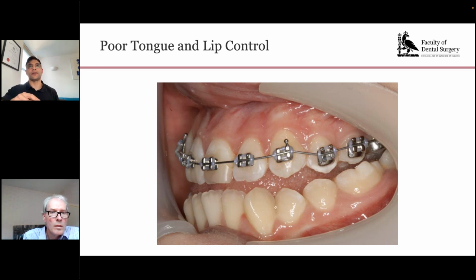And the other thing you need to bear in mind with soft tissue photographs is I think some people get very caught up in trying to take a photograph of the very small part of the soft tissue that they're working on. So if they've done a gingivectomy or something like that, they'll focus on the teeth that they've performed that gingivectomy on, and the quality of the macro lens is often almost invariably so good that you can take a photograph that is not so zoomed in on that one particular detail and then crop it to the area of interest.